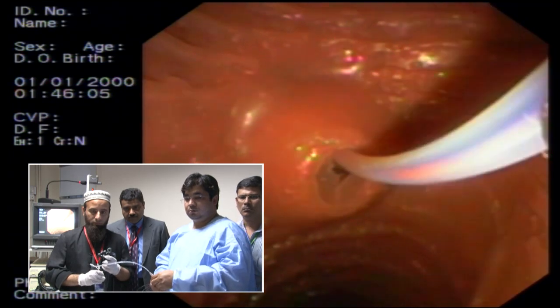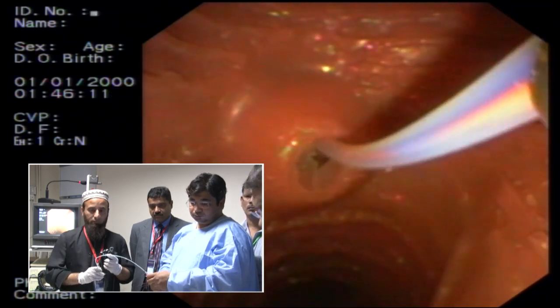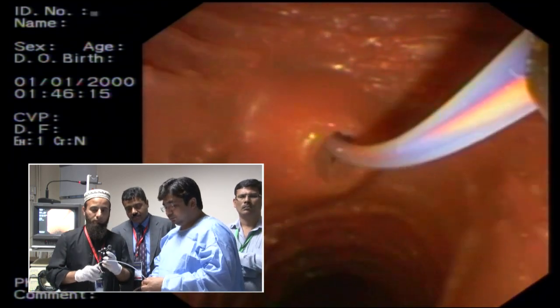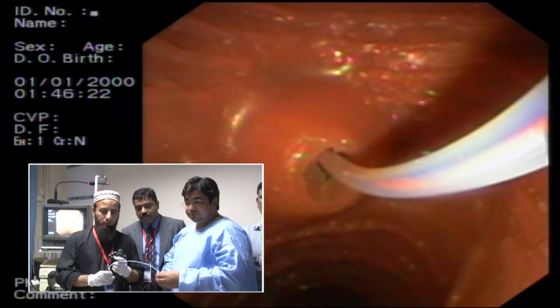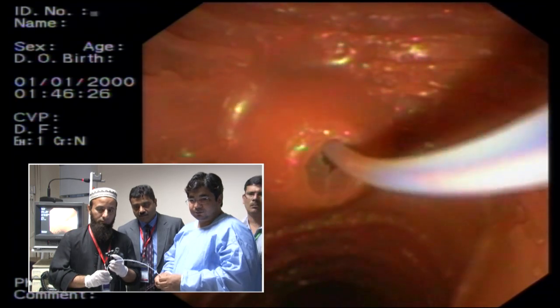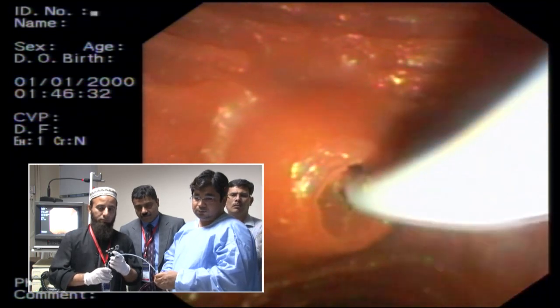अगर आप इसको बगैर उसके कर लो ना तो इससे आपकी प्रॉब्लम नहीं होती. For most cases you don't need to, ज़्यादा सिर्फ elevator से थोड़ा सा अंदर डालने के लिए डाल, and then you can use the big wheel and in and out in that trust. In fact, if the tightest of the stricture, actually the way stent goes up is by pulling the scope back more than anything else. So it's a combination of pulling the scope back, little bit of big wheel, and your technician actually pulling the catheter, and you just generally go back.